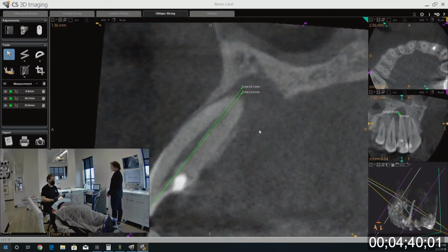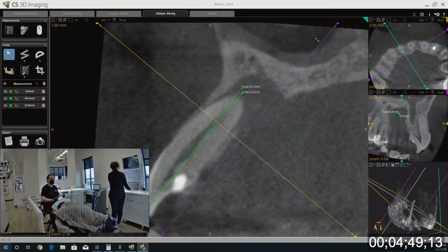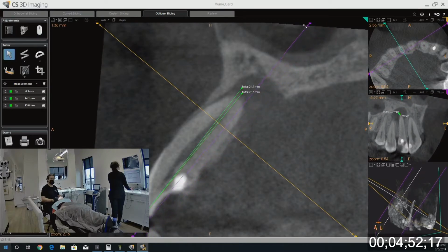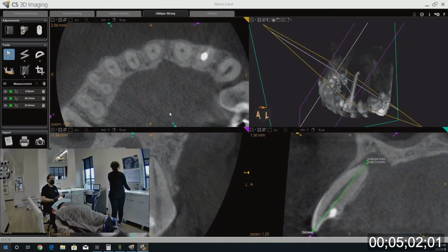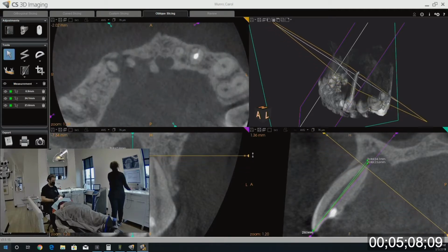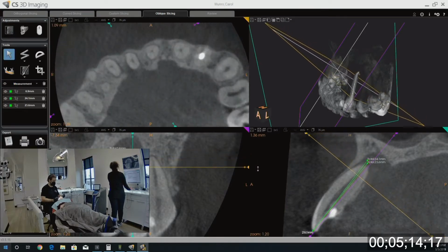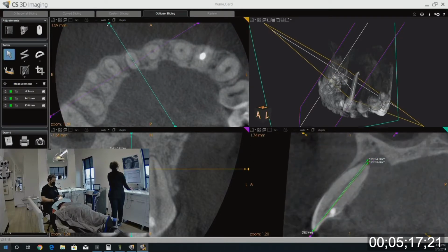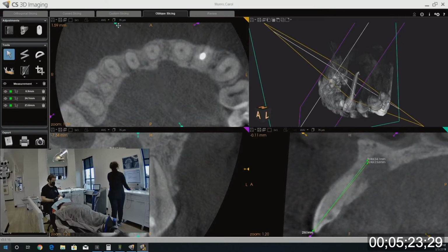Now, if you want to dance through the different 3 planes on that, just do the yellow, purple, go back and forth. Just show the audience what's going on. In fact, why don't you go back to the 3-plane view? Just shrink the other one. Same one you touched before. And then dance through that all. See the nasopalatine duct, it clearly looks like 6 is involved, although it's a pretty obvious response to cold today, as we talked about. And 7 was definitely necrotic.